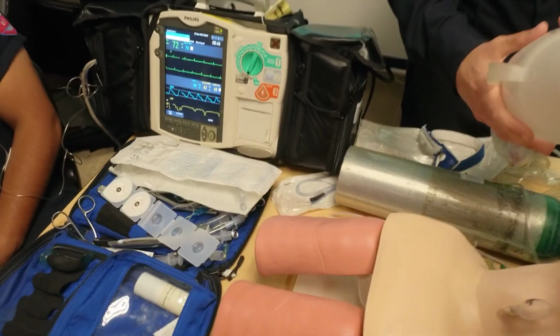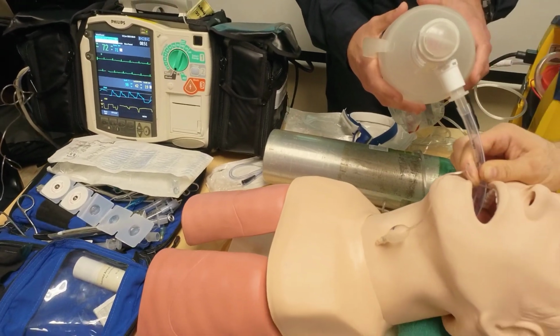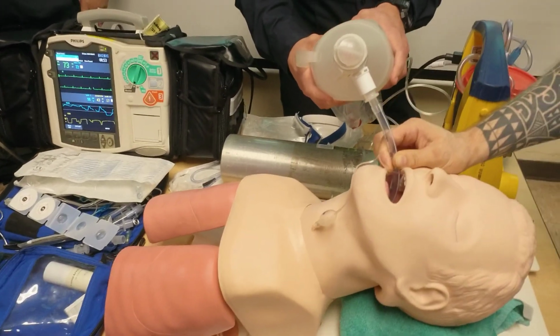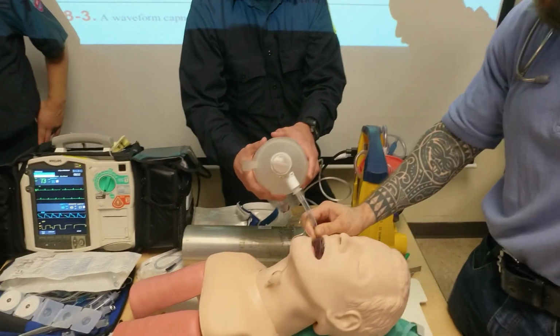Yeah. What's my pulse ox? 98. Right? So he's squeezing. Am I in the right place? Yes. I saw it go through the vocal cords. 35, 45, 99, 98, 99. Right? I'm not done. I'm not going to put it in my ears.